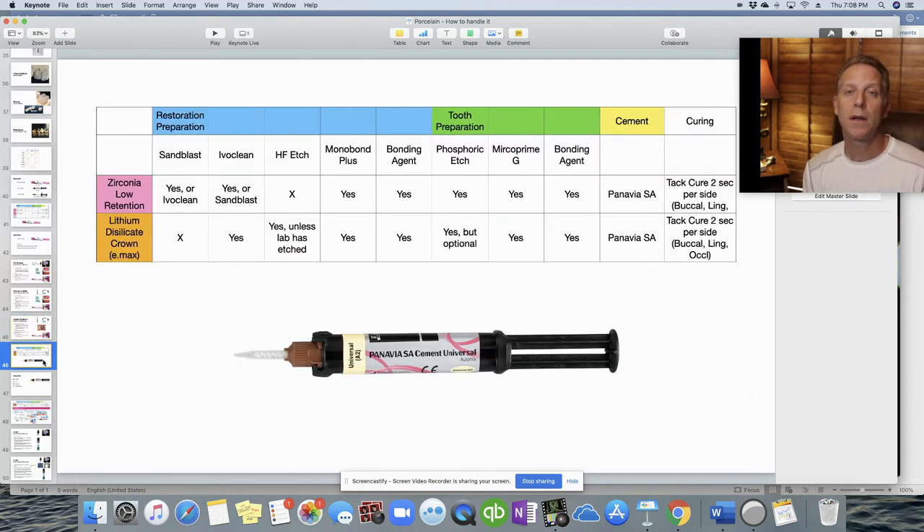Moving on to resin cement: Panavia SA Cement Universal, made by Kuraray Dental. This is used for two main indications: Emax or lithium disilicate crowns, and also for a zirconia with low retention — a very small or tapered prep where you don't think resin modified glass ionomer will be strong enough. Using Panavia increases retention in those cases.